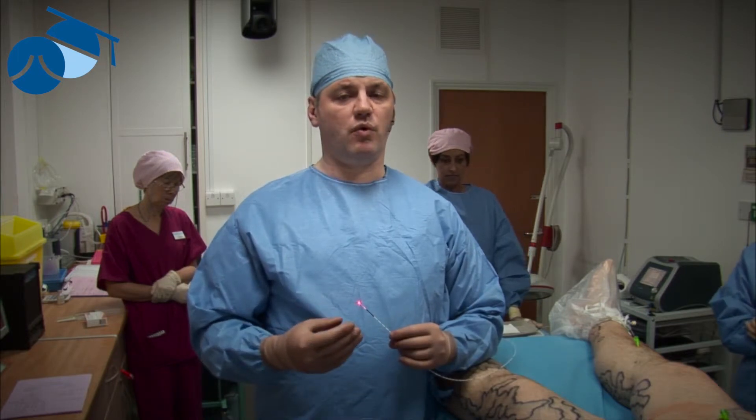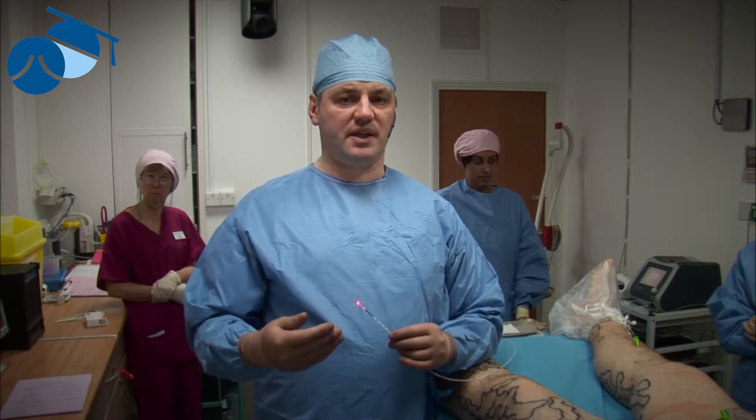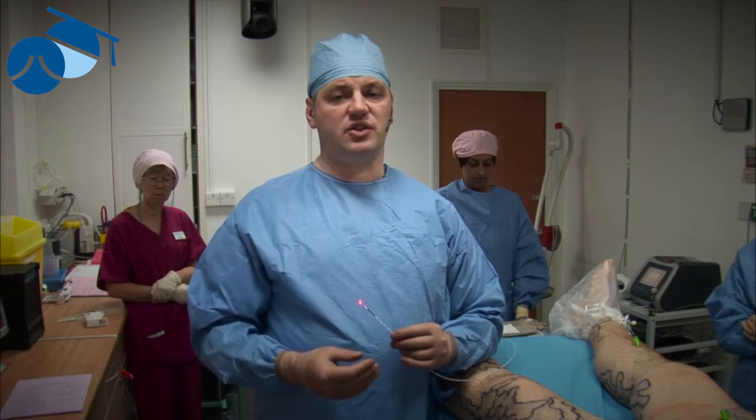Endovenous laser is one of the two commonly used thermoablation techniques. The idea with thermoablation techniques is to heat the vein wall from the inside, which completely destroys it. Unlike the stripping techniques where the vein was removed — which causes a lot of pain and damage — stripping also causes the remaining ends of the veins to just grow back again.